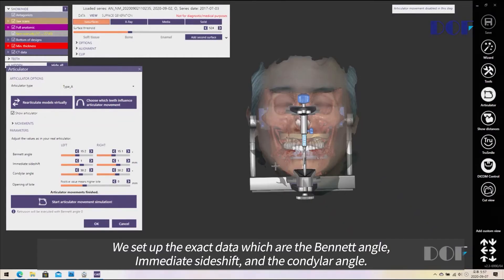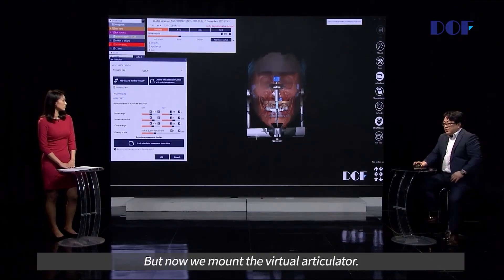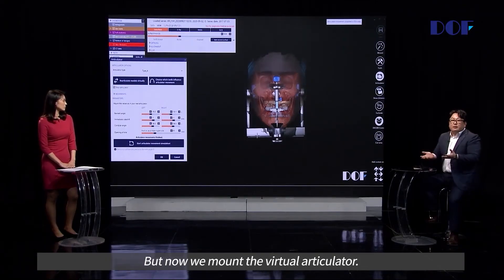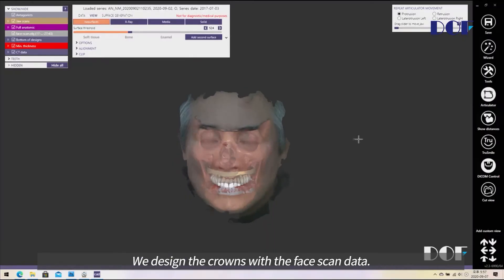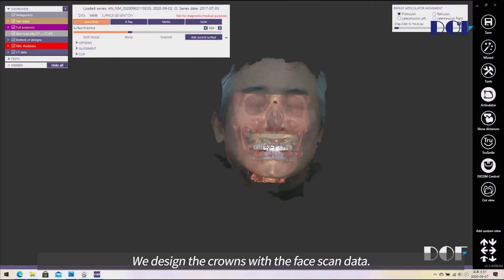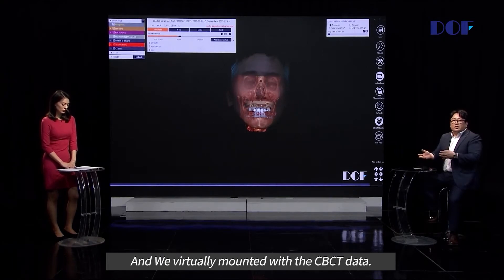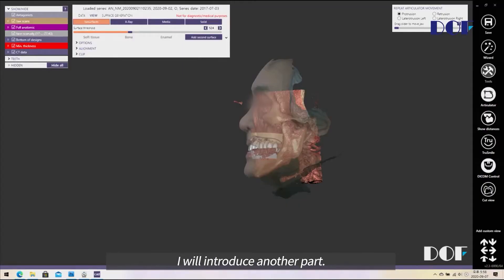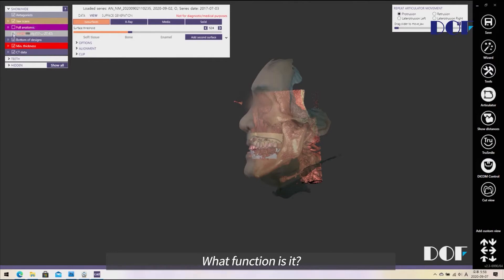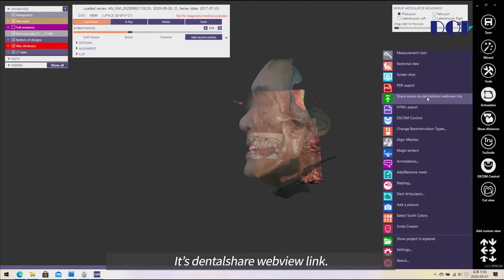The Bennett angle, immediate side shift, and condyle angle parameters come from the Zebris system. But now we are using arbitrary mounting. We designed the crown with the face scan data, imported the CBCT data, and mounted with the CBCT data. Dr. Wu will now introduce another part — the dentalshare function.